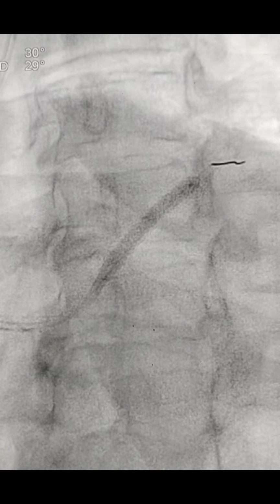Now we wanted to keep 1 or 2 struts in the aorta, and so this is the stent placement. This is a caudal view, and we deployed this stent at 12 atmospheric pressure, and this is the picture. So the stent is well expanded from this angiographic view, and 1 or 2 struts are in the aorta. So we wanted to flare that.